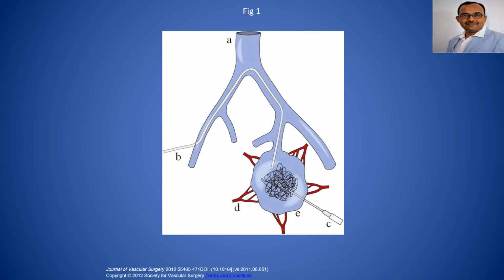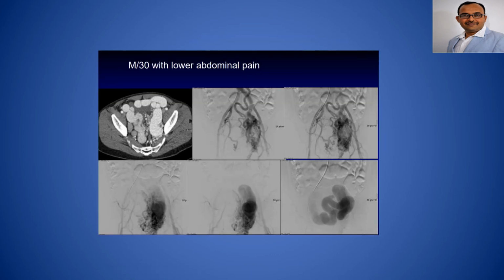So to reduce it, first we have to convert this high flow vascular malformation to a low flow vascular malformation by blocking the dominant draining vein with multiple coils. Once we do it, then inject the ethanol within this nidus and destroy the nidus, so this vascular malformation will be cured. Now let's see the practical case.